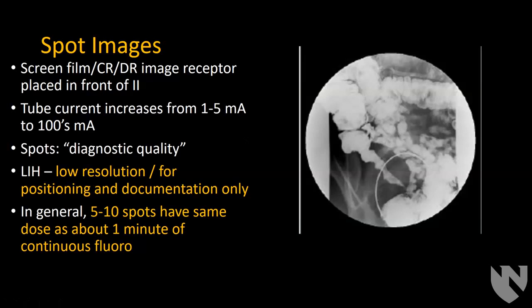You can do last image hold, which is just saving the last frame from a fluoro study, but that's going to be low resolution. But if you want a high resolution diagnostic quality image, you can do it in exposure, but of course you're going to have a higher dose. And in general, 5 to 10 spots will have the same dose as about 1 minute of continuous fluoro.